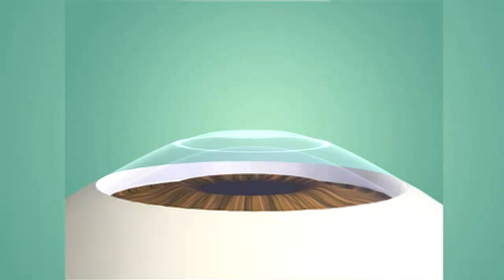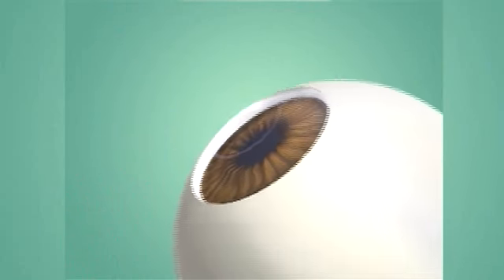The laser removes tissue, either decreasing the curve of your cornea to correct nearsightedness or increasing the curve of your cornea to correct farsightedness. After the procedure, a contact lens is placed over the cornea to promote healing.